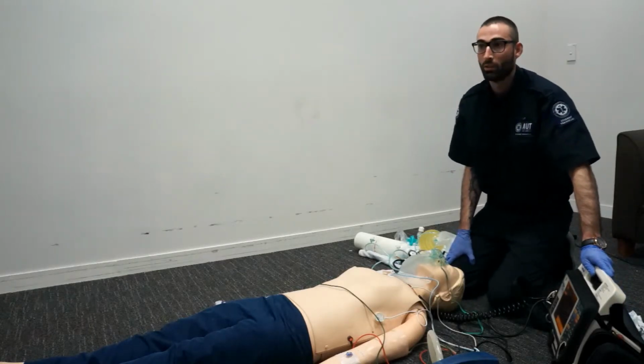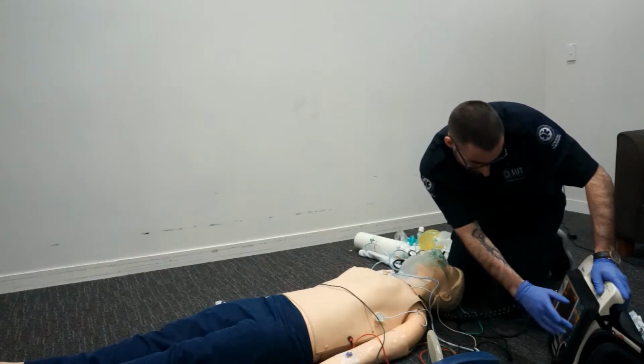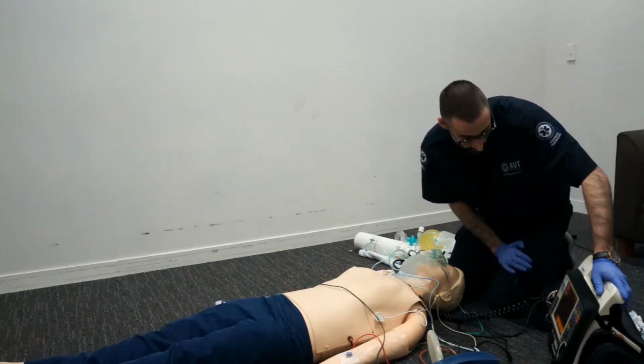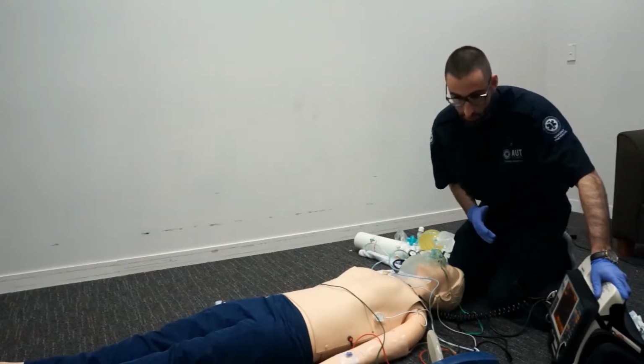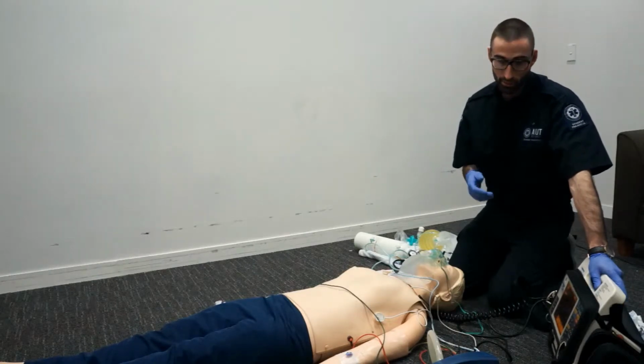Select synchronize mode. Okay, sync. Confirm there is a detection symbol above every QRS complex. Okay, yep, we have a detection symbol on every QRS complex. This is important to note as we don't want R on T, as this can cause cardiac arrest or torsades.